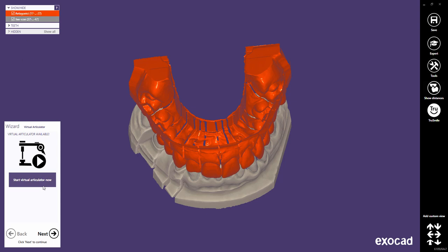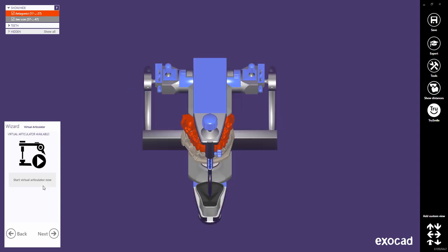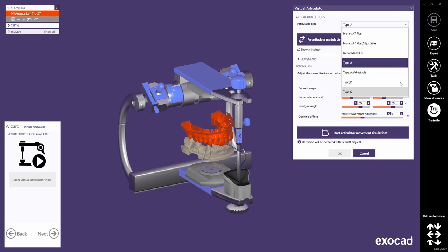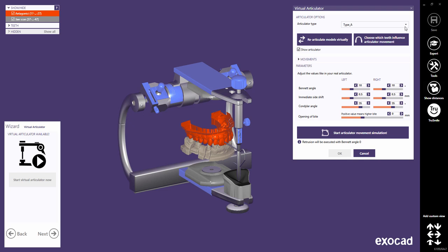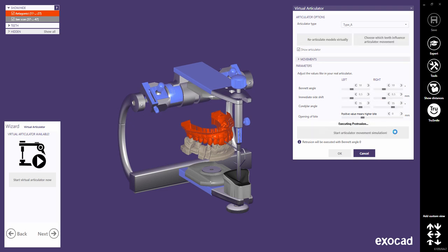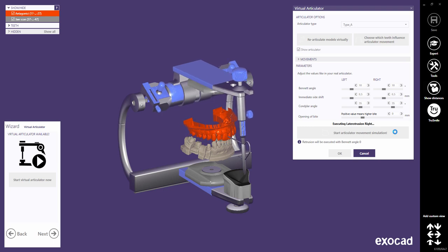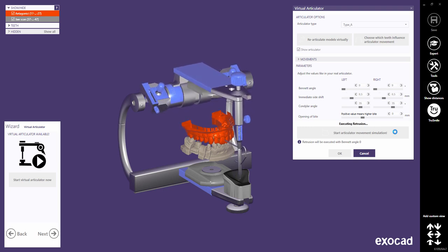Let's start with the Articulator. Note that if you don't want to use the Articulator, simply click Next in the wizard to skip this step. I don't want to go too much into detail about the Virtual Articulator feature with its different Articulator types and parameters — this will be explained in a separate tutorial. I directly start the Articulator movement simulation with the default parameters. Note that this operation must be executed before clicking OK in order to save the Articulator movements for a dynamic occlusion adaption later.